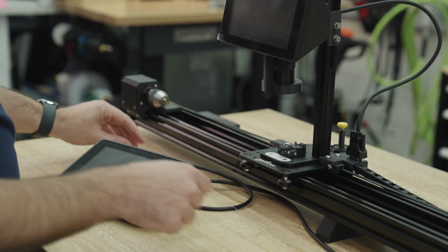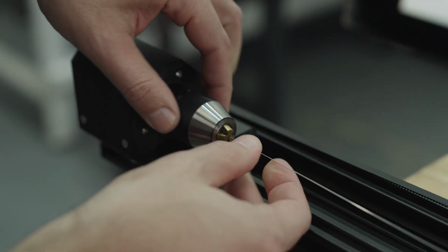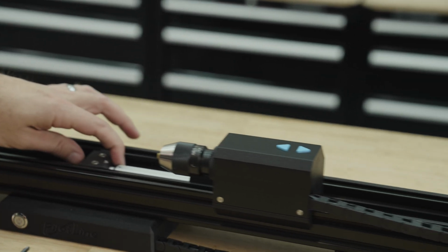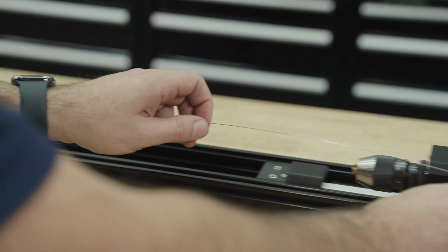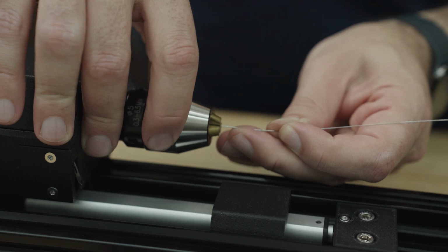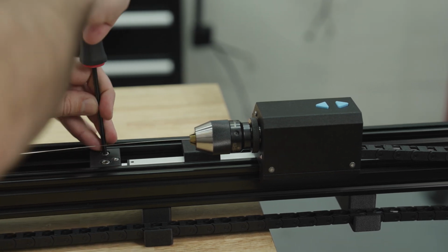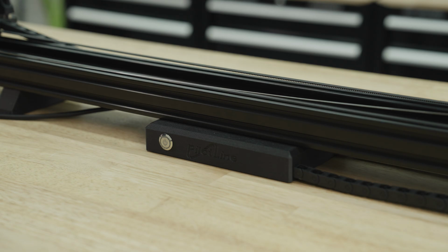Now that the mandrel guide is installed, we'll go ahead and place the mandrels in the chucks. And next, the subspindle. The subspindle can be positioned as needed depending on the length of your mandrel. Once the mandrel is threaded into the subspindle, you can tighten the cleats here, and we're done. Now let's power on the machine.